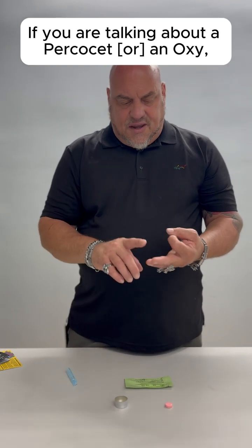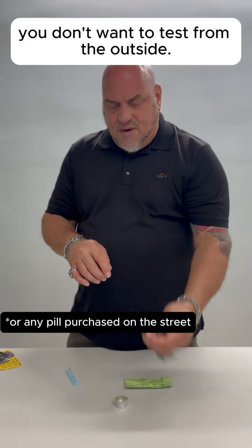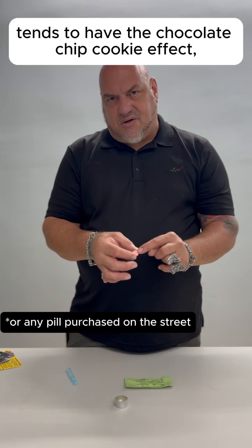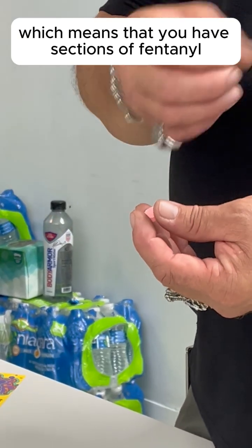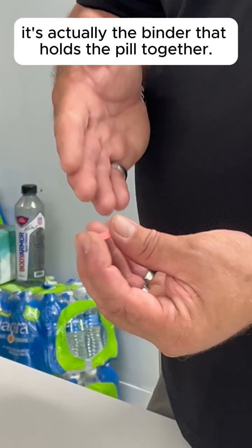If you were talking about a Percocet or an Oxy, you don't want to test from the outside. The pill sometimes tends to have the chocolate chip cookie effect, which means that you have sections of fentanyl and sections where it's actually the binder that holds the pill together.